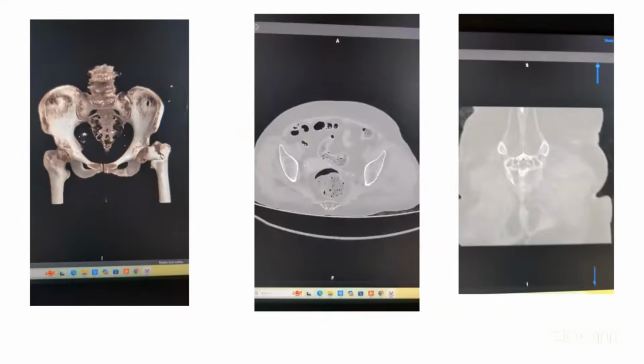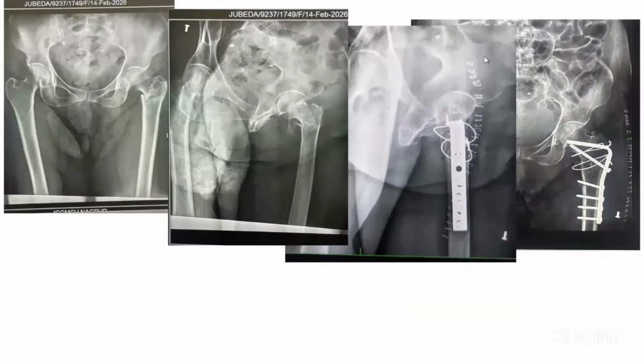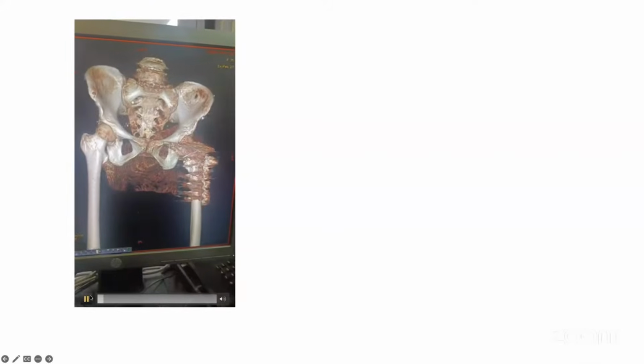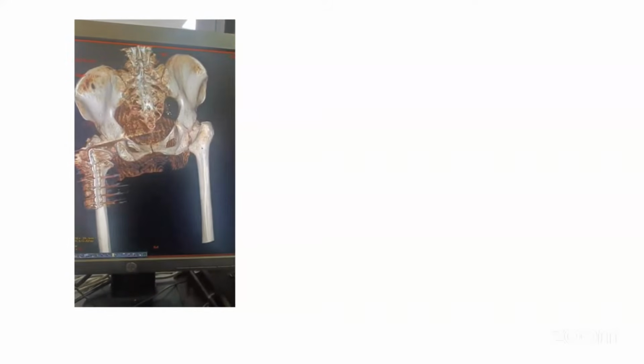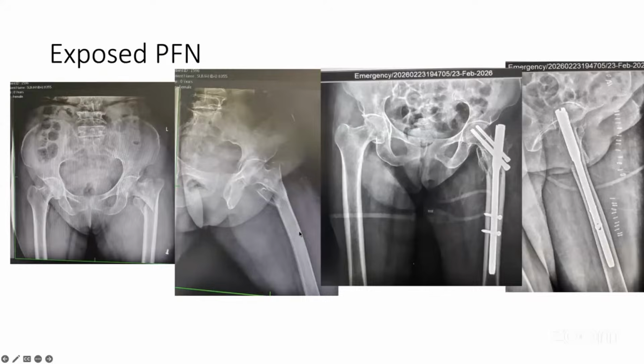Here is another patient, with an intertrochanteric fracture, treated with the cerclage wire, an angle blade plate and cancellous screws. You can evaluate this with the CT scan. You can see that the lesser trochanter is very well held with this trochanteric combination. And posteriorly, whatever gaps are there, the implant is contained in the femoral head neck element. So this is very important.